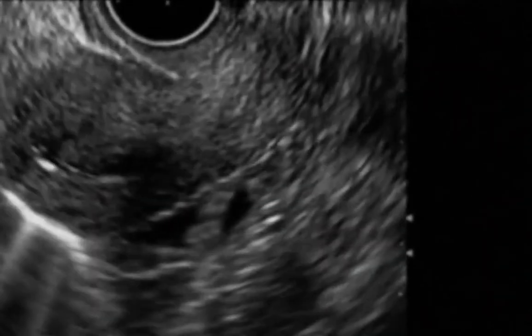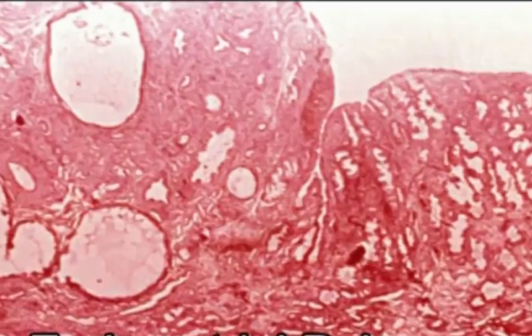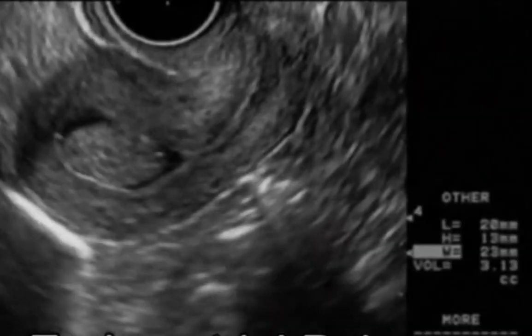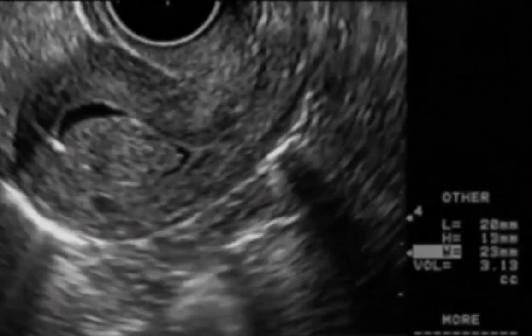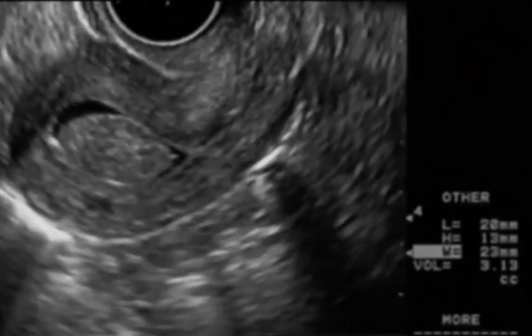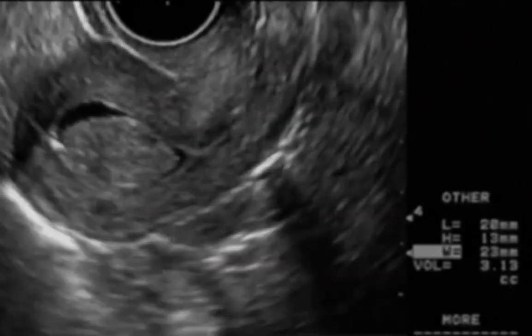The presumed thickening seen on simple transvaginal ultrasound was actually a large endometrial polyp with cystic collections seen within it. We were able to identify the attachment point on the posterior wall of the uterus. This simple explanation for her menorrhagia and dysmenorrhea was easily fixed with an outpatient hysteroscopic removal of the polyp. Following surgery, her periods were light and lasted 3 days.